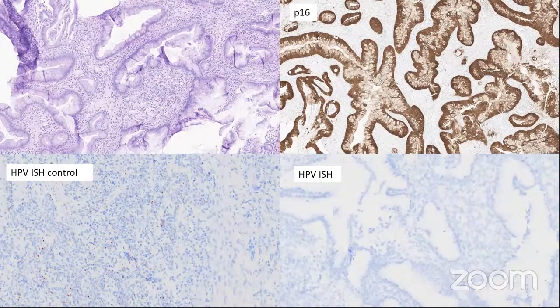As I mentioned, gastric type tumors should be P16 focal or negative, but there are always exceptions. Here's an example of a tumor that I thought was gastric type, but then the P16 was diffusely positive. So we went ahead and did the HPV in situ hybridization, which was negative in the tumor. And you can see it compared to the nice control of what HPV positivity should look like.